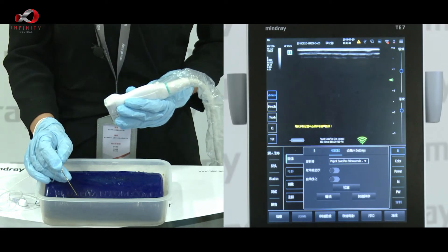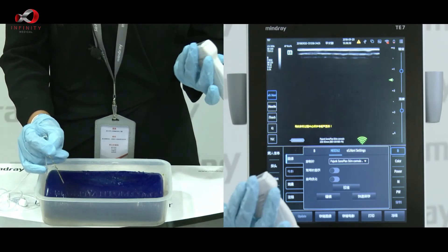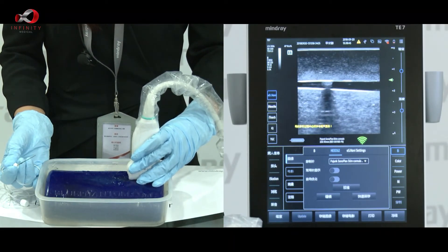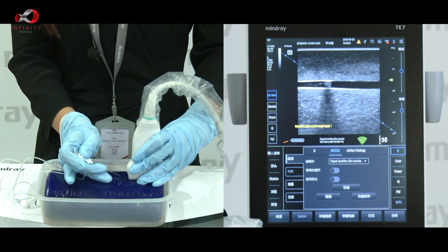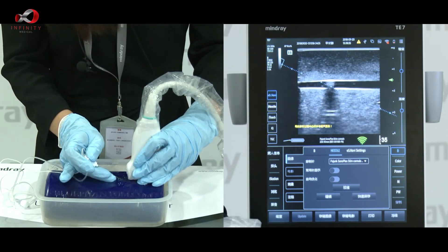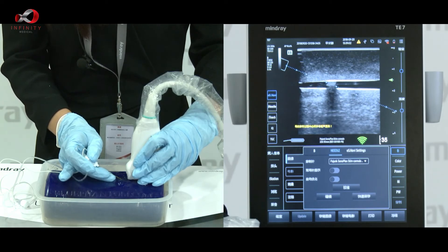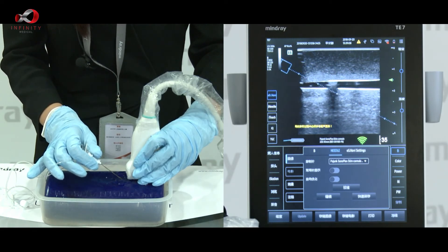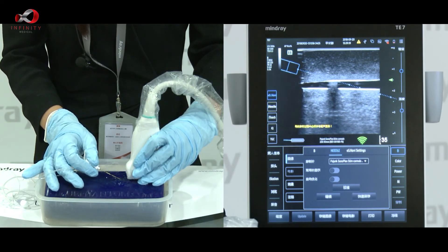Let's move on to the in-plane position. It is the same as our out-of-plane puncture — we also apply the one-motion method for approaching. On the screen, try to find a target, then use the one-motion method to gently prick the needle tip into our phantom. You can see an extended blue dot line, which is our trajectory line. We can adjust the needle up and down for changing the direction of our trajectory line. Once our target is set, we can push the needle in.